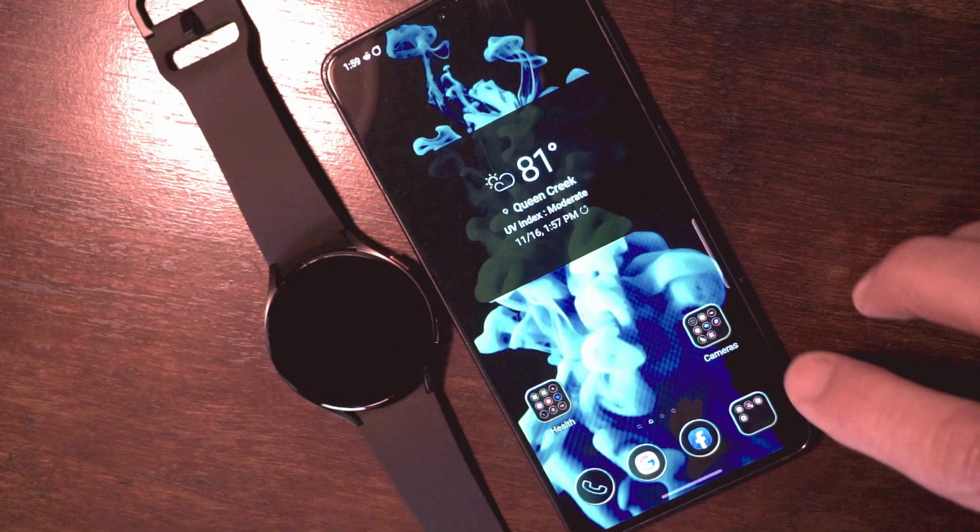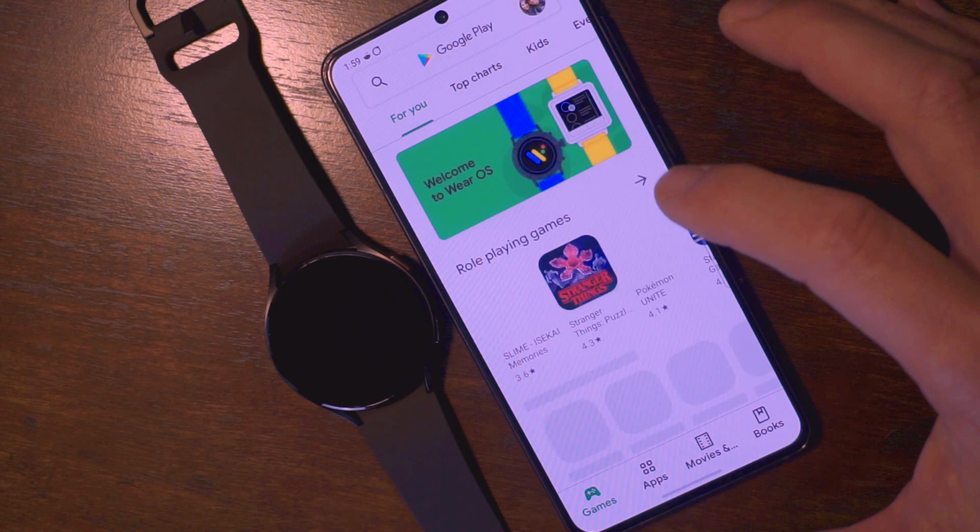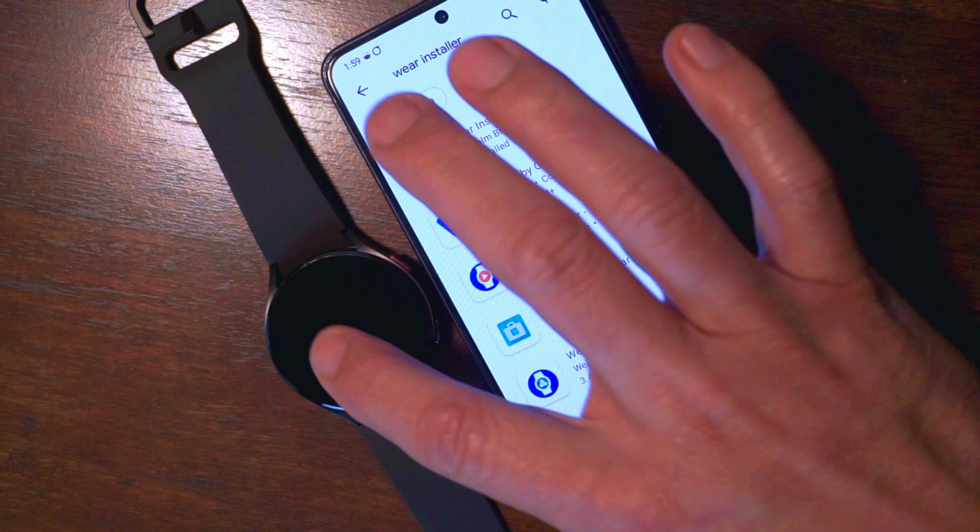But I'm guessing if you're watching this video, it still doesn't work for you and they still haven't patched it. So here's how I got it to work. I originally located this process under a Reddit thread, but it was missing two components that I discovered and I'll share with you at the end of this video. Okay, so after linking my smart device to my phone, I opened up the Google Play Store from my Galaxy S21. I searched up the Wear Installer app and downloaded it to both my phone and also to my watch.